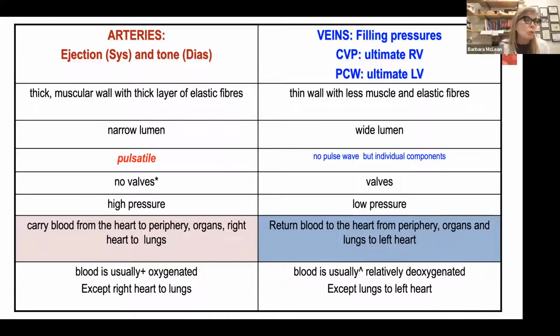Now, those of you who are CVICU nurses already say, well, here's a problem with that: what if the valve is regurgitating? Phenomenal. That's really important when we're talking about venous pressure. So I want to remind you that you have an expectation of fluctuating waves, and that those fluctuating waves are small. They're not phasic, they're not large, and they're about equal in height to each other. That's really important. And we're going to look at those waves in a few seconds, okay?